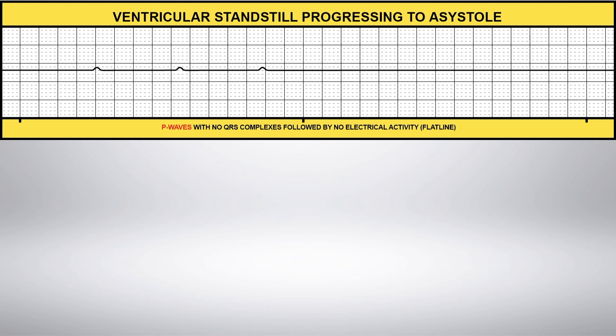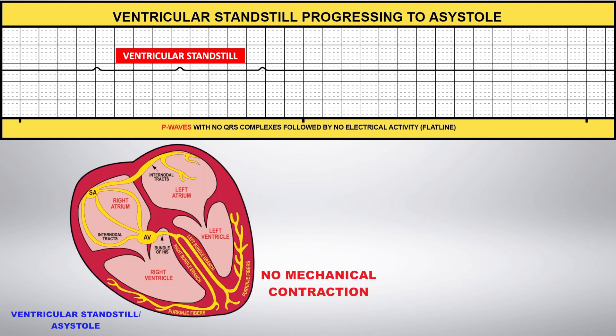Ventricular standstill occurs when you have only atrial depolarization and there is no ventricular depolarization. The P waves are present, but there are no QRS complexes, so there is no pulse.